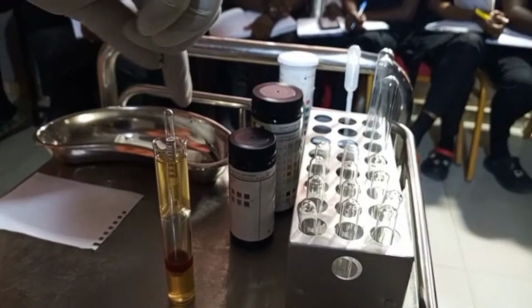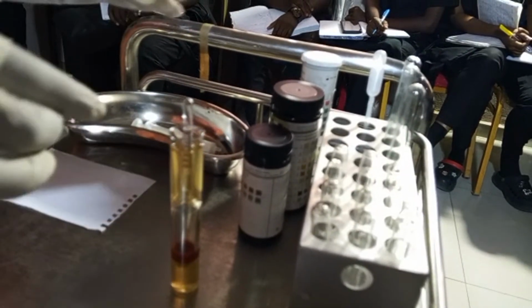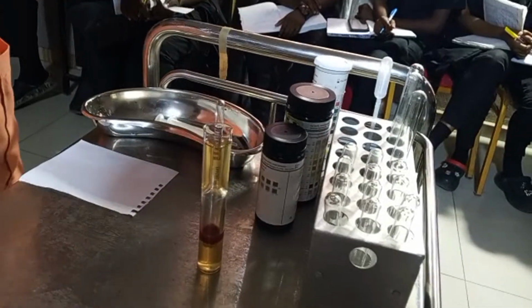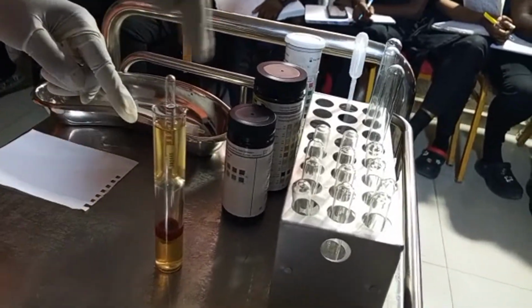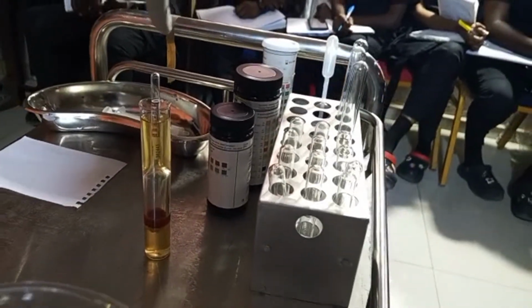Do you see where the urine stops? On top, right? The number where the urine stops there, that is your specific gravity. Not the one inside, just the one at the top where the urine stops.